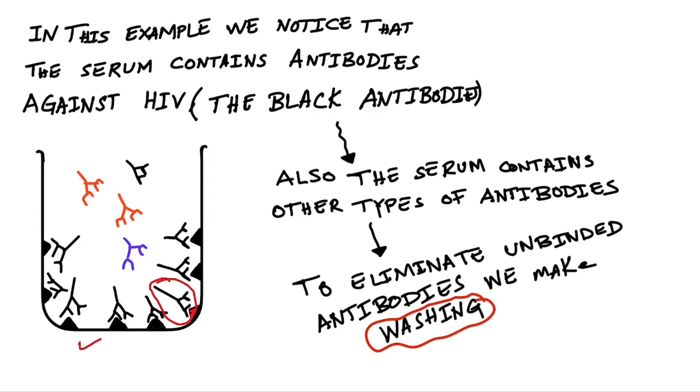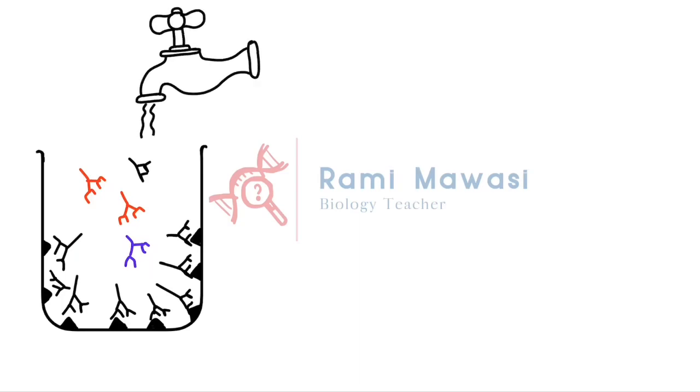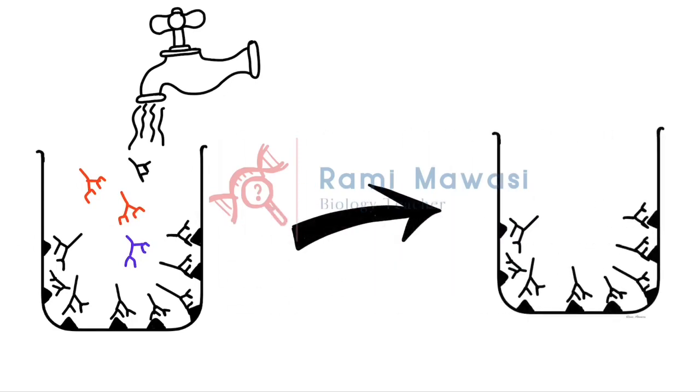We notice that the serum contains antibodies against HIV, the black antibodies. Also, the serum contains other types of antibodies. So to eliminate these free antibodies, you have to make washing. After washing, what remains is the fixed antibodies.